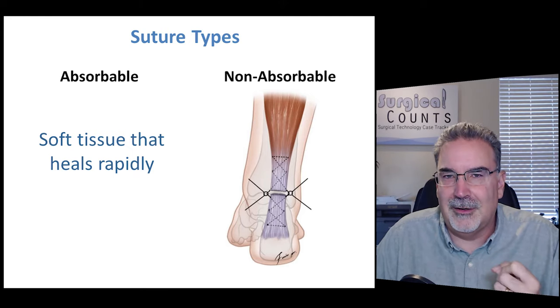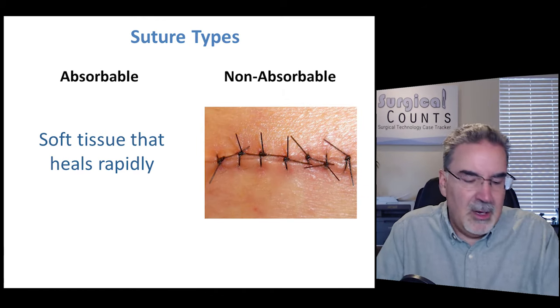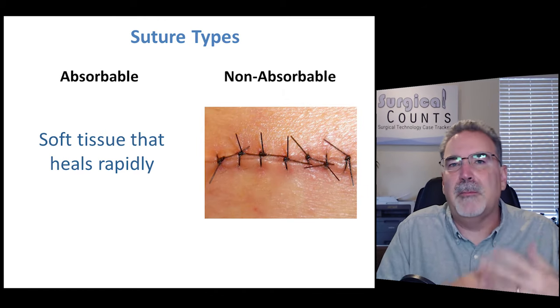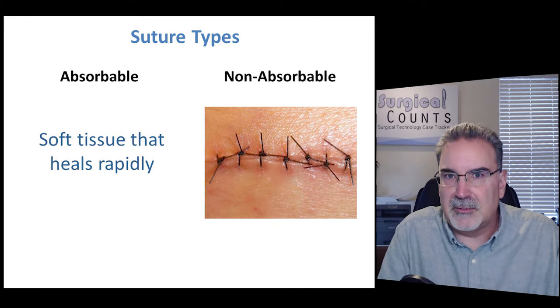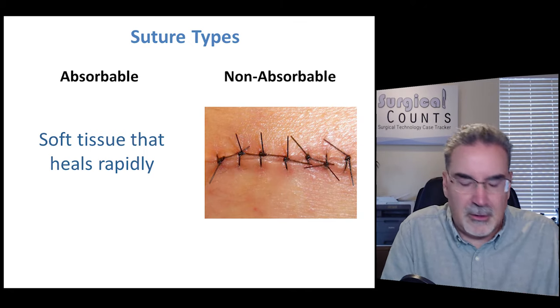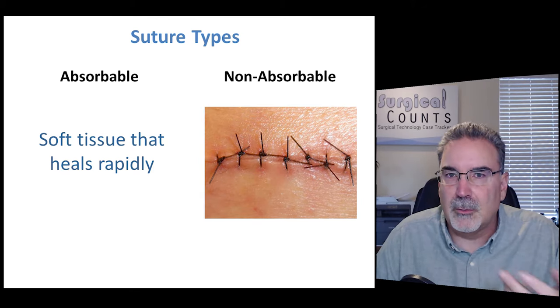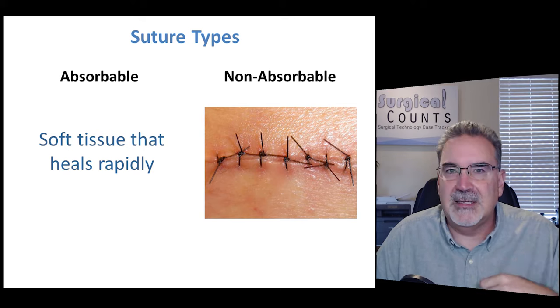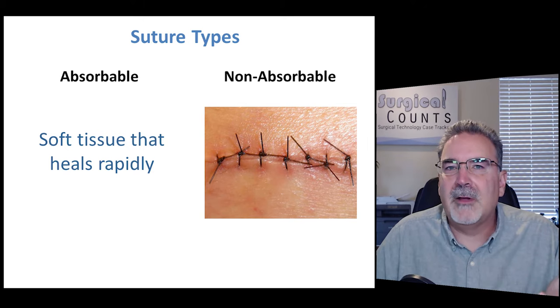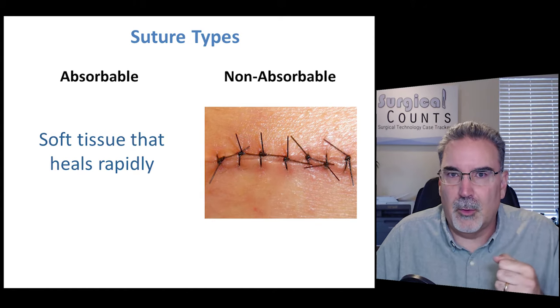And one other case where you might use non-absorbable sutures, even on skin, you could do this. If you have a patient, let's say they're staying in the hospital for a long time and they're getting constant care, and there's always going to be a doctor or a nurse there to remove any sutures that might be there, you can use non-absorbable sutures then because they're fairly easy to take out. So one way of classifying sutures is absorbable versus non-absorbable.